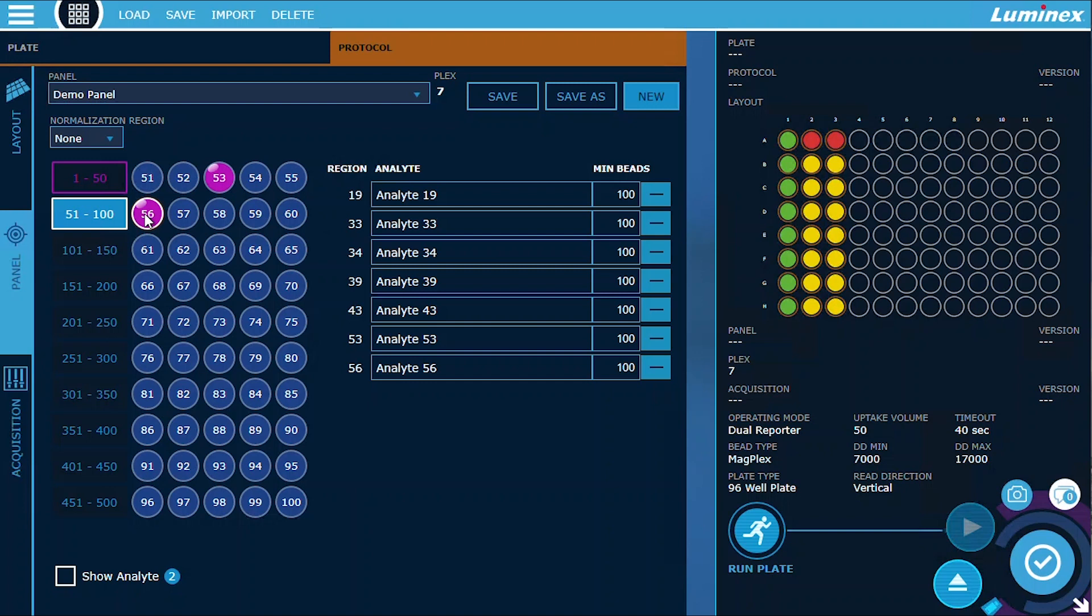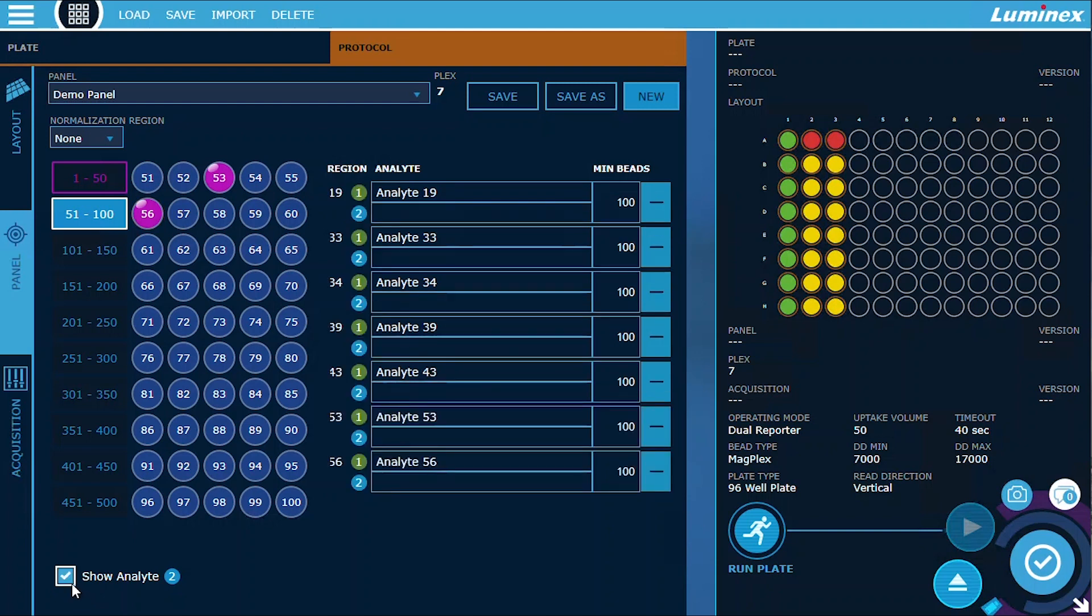Additionally, we understand that sometimes you may not require the second reporter channel. Therefore, we've added a convenient toggle option, allowing you to easily disable the second channel entry field if it's not needed for your specific assay.